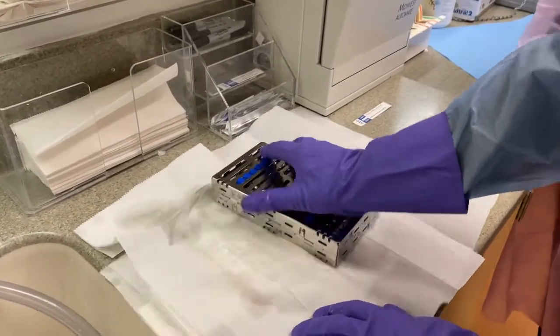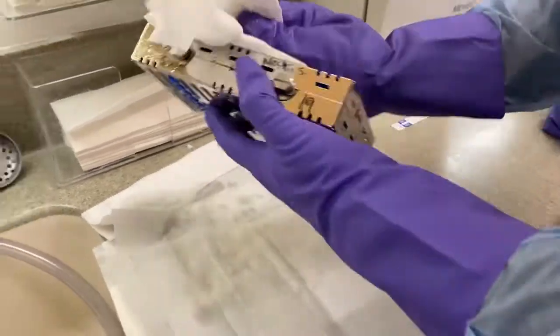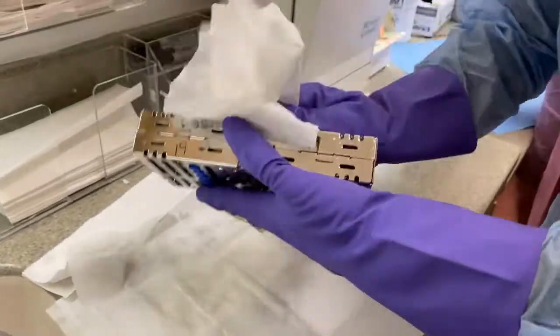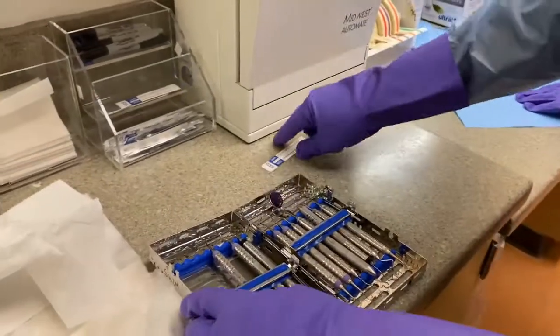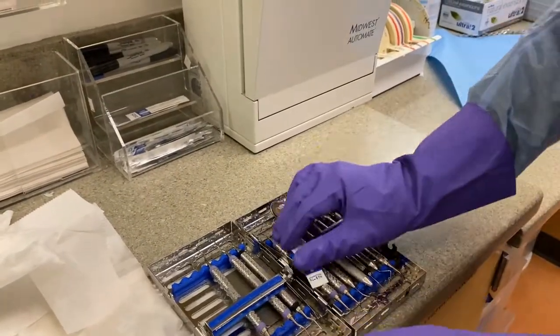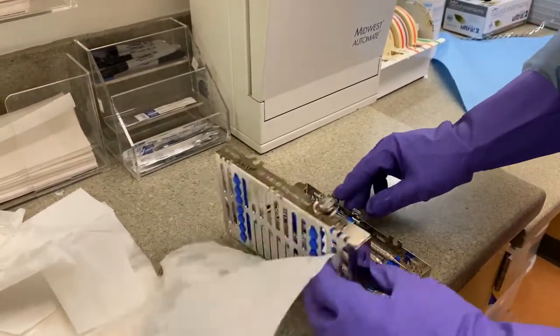Place an internal indicator which has the parameters of time, temperature, and pressure. Make sure that the cassette is correctly labeled with the clinician's first and last initial and their number.